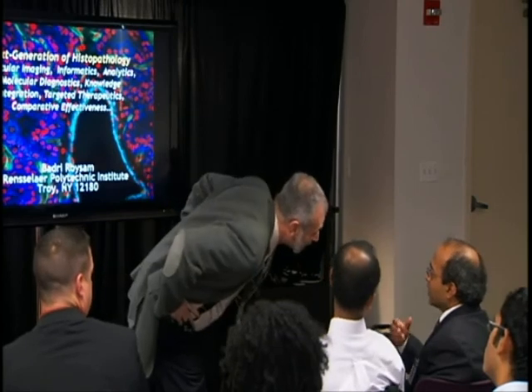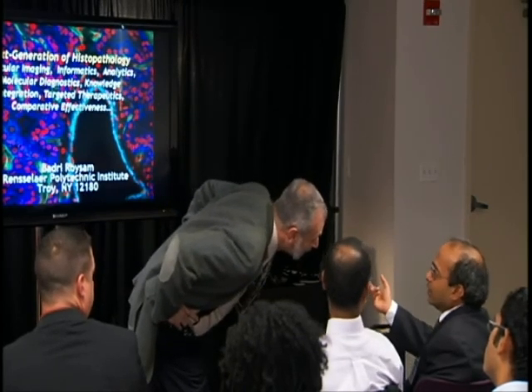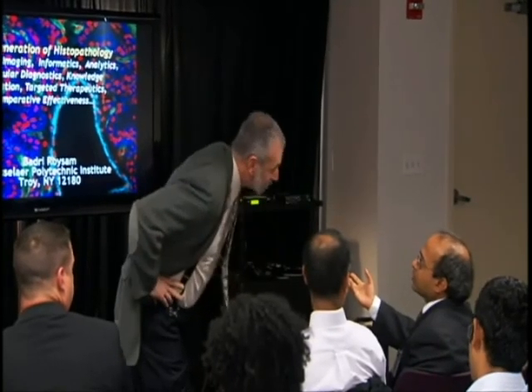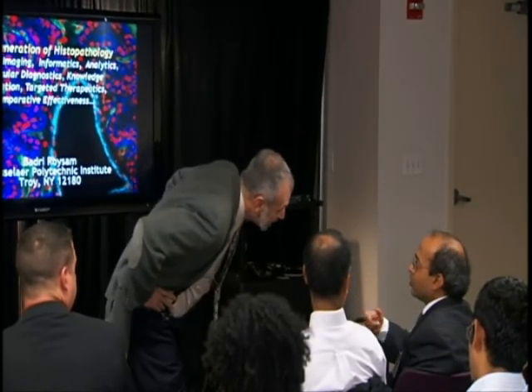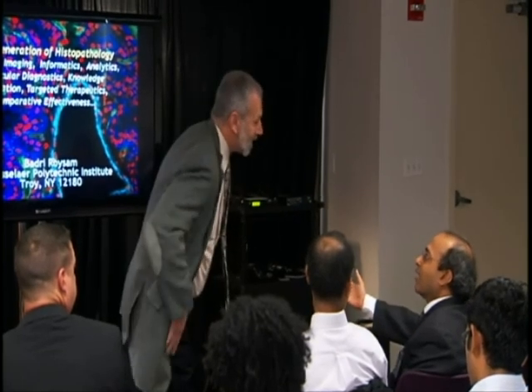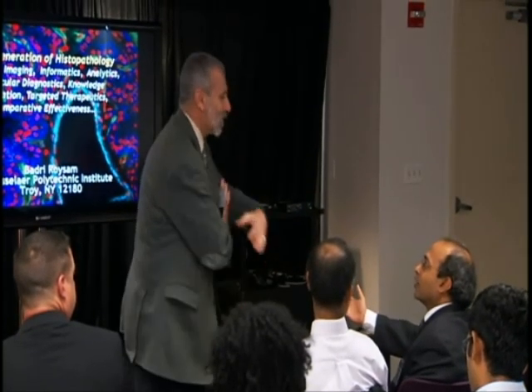Okay, so the first question again. You didn't show any immunolabeling type information, so how do you know, you made some conclusions about what you were looking at? Good point. At this point, what we have done is make the measurement on purchased melanin, the squid ink, which is an extremely pure melanin sample.